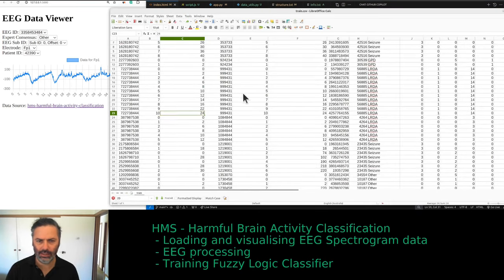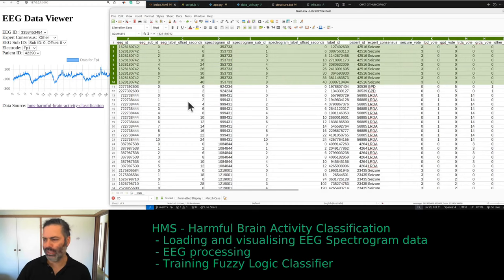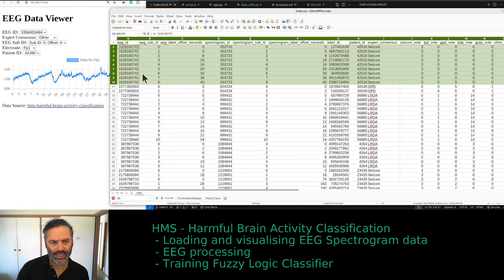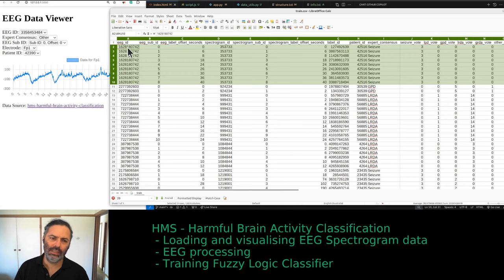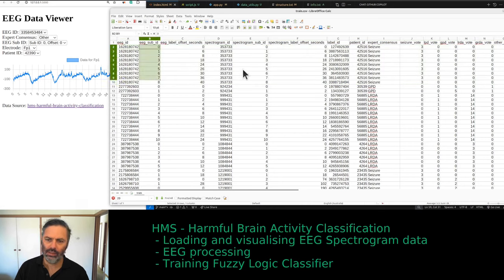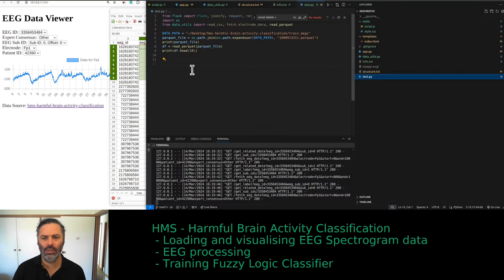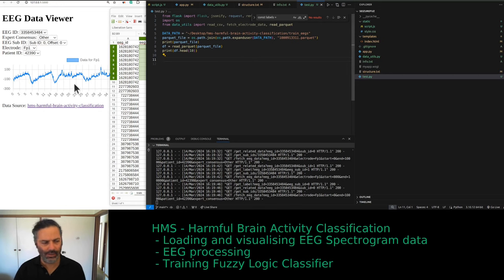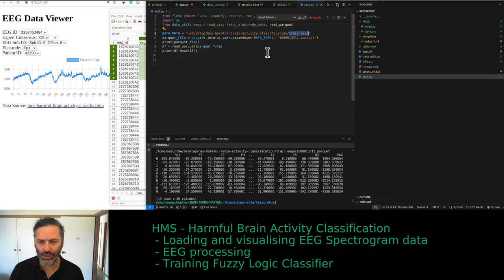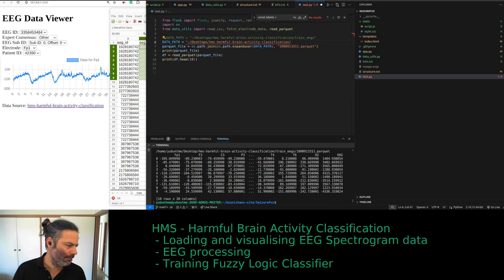Let's think about how this dataset works. We're making an assumption that the EEG ID is the main thing by which we sort and review the data — it's like the unique record number. For each EEG ID you will have a corresponding spectrogram ID. There are different parquet files: one that holds the EEG data called 'train_eegs', and a folder called 'train_spectrograms'.